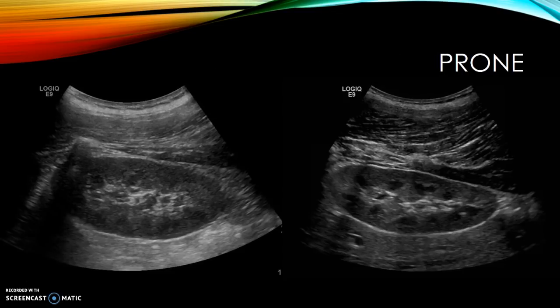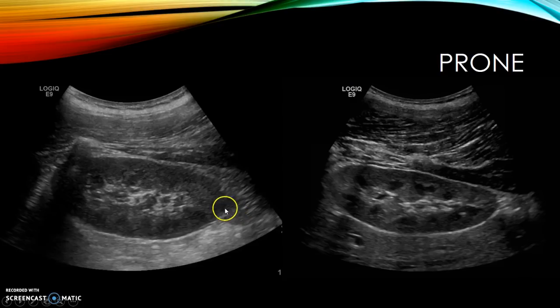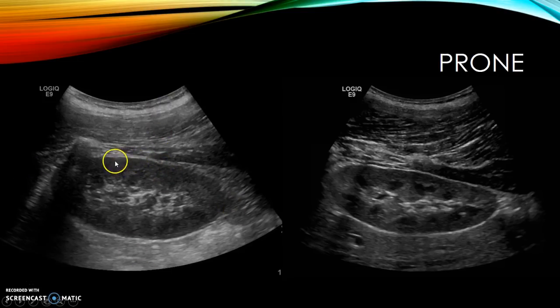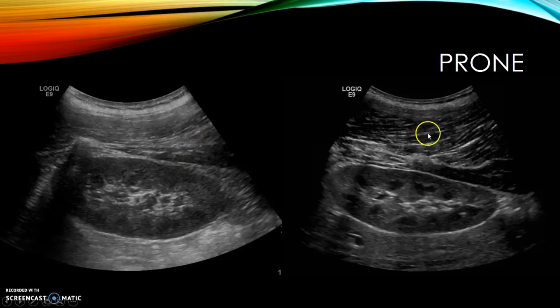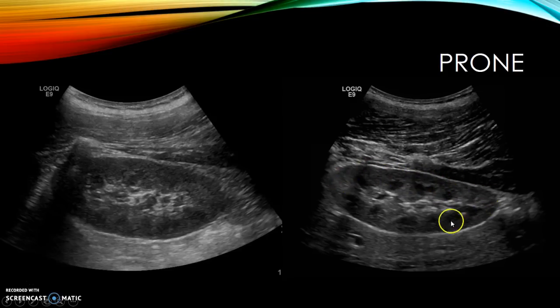On appropriate patients — thinner patients and children — you can place the patient prone and scan through the back for excellent kidney views. This is helpful for evaluating the posterior aspect of the kidney, such as a posterior cyst. You can also use a linear transducer on children for very detailed images. On prone views you can identify the psoas, quadratus lumborum, and back muscles. The corticomedullary differentiation is clearly visible with hypoechoic renal pyramids and more hyperechoic renal cortex.